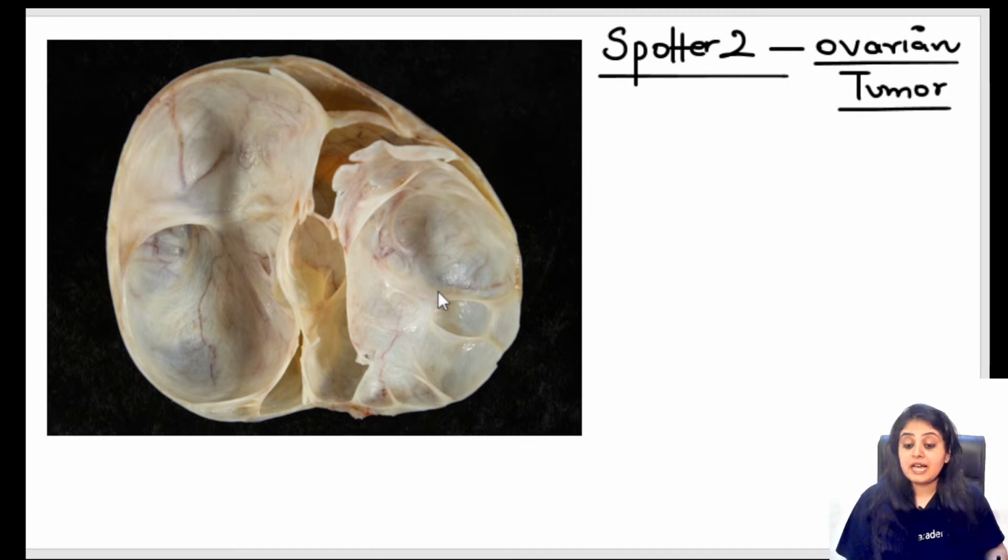Some of you say hydatid cyst. Hydatid cyst, but where? You're only saying cyst. I'm saying the organ is ovary. Ovary showing you a hydatid cyst, obviously that doesn't fit. A hydatid cyst would have been somewhere in the liver or lungs. In the ovary, yes, very good.